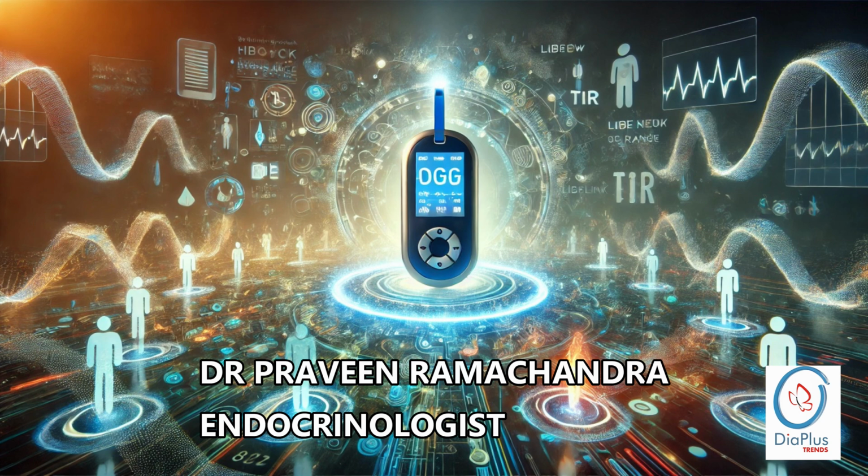Exactly, precisely. And the exciting part is that this level of detail helps us create much more personalized and proactive diabetes management plans. We can start to identify patterns, like maybe you see your glucose spike after certain meals, or maybe it always dips in the afternoon. This lets you make targeted changes, like adjusting your diet, exercise, or medication to get better control. So it sounds like TIR shifts our focus from just reacting to highs and lows to understanding the why behind them so we can be more proactive.